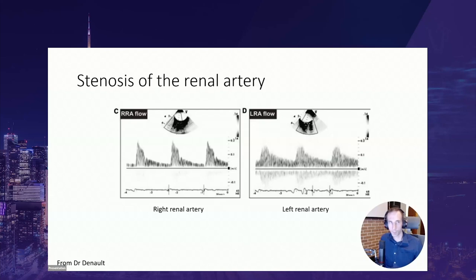Any obstruction in the renal artery can also affect the arterial Doppler waveform. This is a case where an aortic prosthesis was being installed for a type 2 aortic dissection. On the left is the right renal artery waveform with a high resistive index, likely due to the patient's baseline characteristics. On the right is the left renal artery waveform, which was being partially obstructed by the aortic prosthesis — causing a blunted waveform and a paradoxically lower renal resistive index compared to the contralateral side.